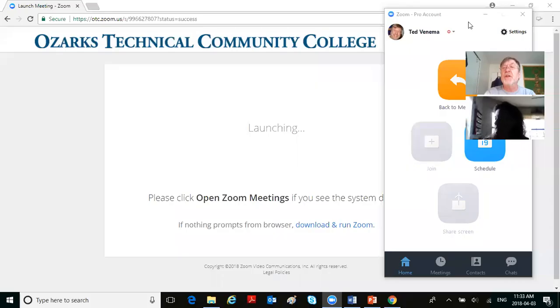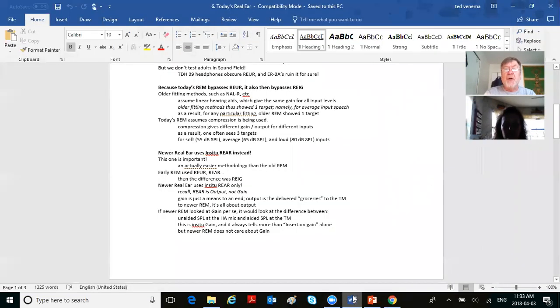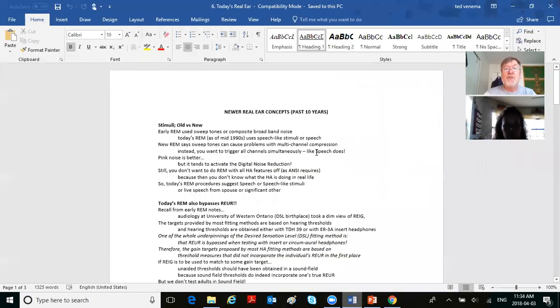So anyone who did attend the lab on March 30th on Friday, you may have had somewhat of a preview to some of the PowerPoint slides here. But what I'll show you here is notes in PowerPoint as per usual. And let me collapse this. Here we go, looking at our notes, newer real ear concepts. And this is especially over the past 10 years.